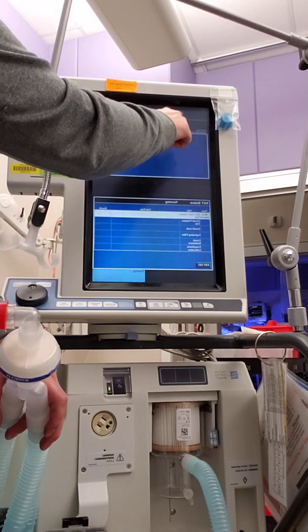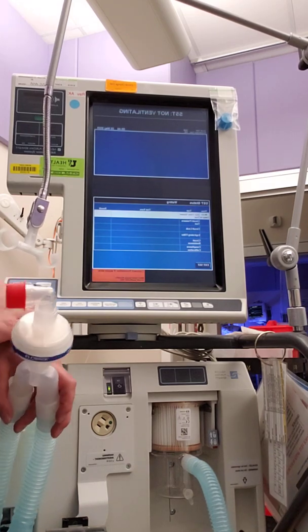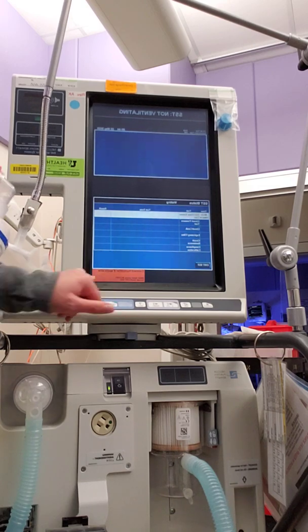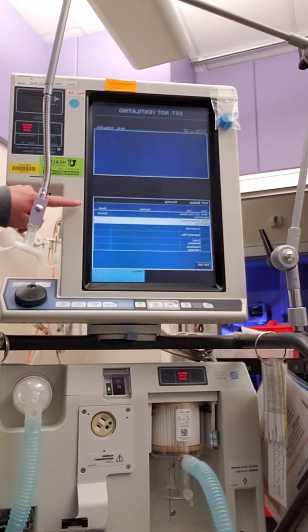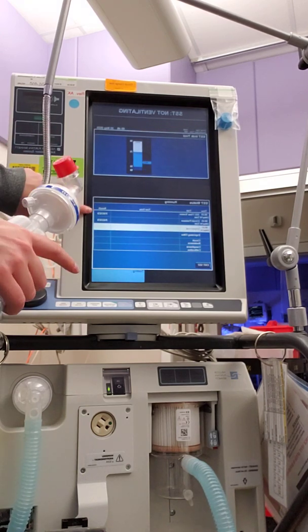Up here you can see it says we are in SST, so we are not ventilating a patient at the moment. Okay. Connect humidifier if applicable. Okay, so we're not connected to humidifier, so we press accept. Over here you can see the result. We have passed. It's going to continue on to circuit pressure test. We passed.